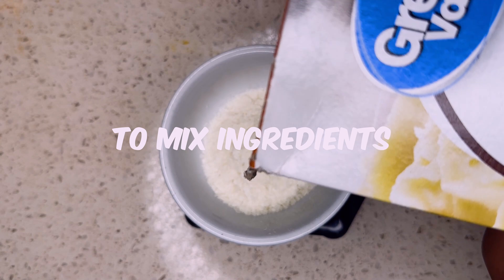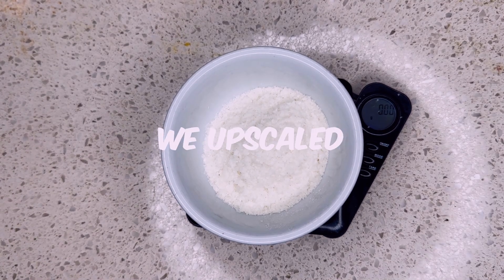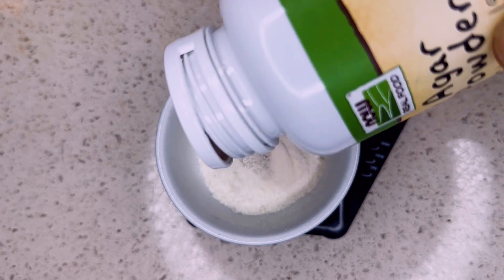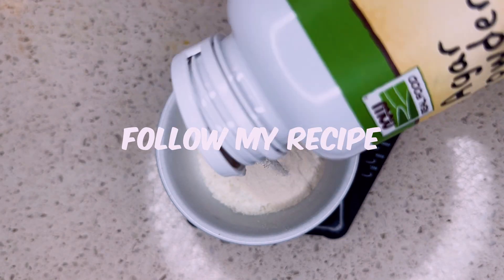Now it's time to mix our ingredients. When mixing, I always do your dry ingredients first. Now remember, we upscaled this recipe — so instead of 3-2-1, we're using 12, 8, 4, and about 2 cups of water. So if you want to follow my recipe, that's what I use. I got a lot of agar cups to pour.